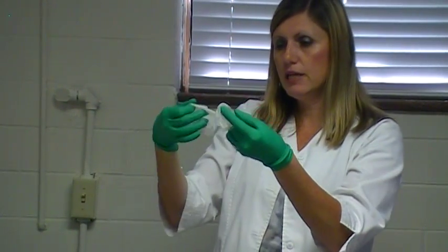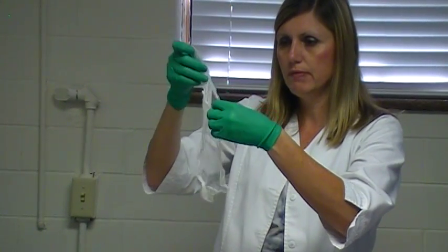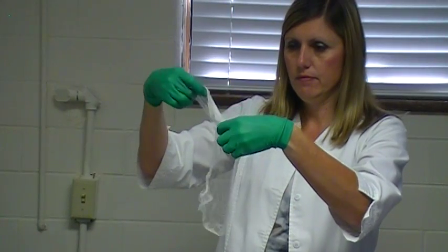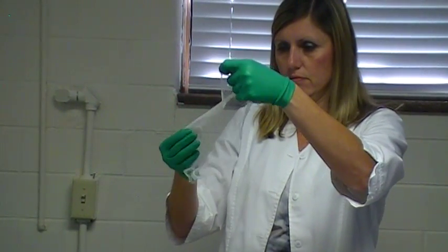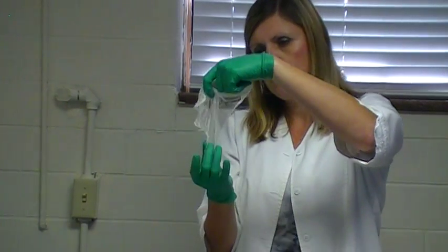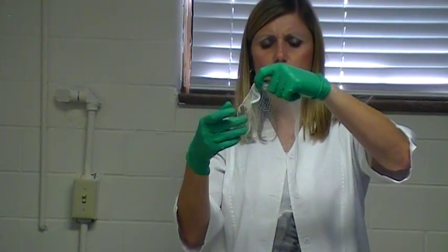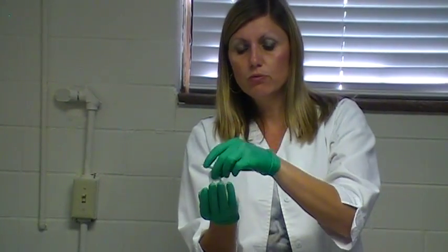Do not touch it to anything that's not sterile, or it is contaminated if you do. Once you have opened it completely, and sometimes this takes a little bit of time to get it opened all the way, you'll want to lay it in one of your hands.